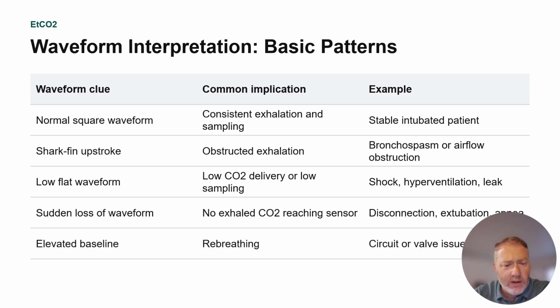And then if there's an elevated baseline, so remember the base of that waveform should be 0, right? If it went from 0 to here, and then your waveform, that indicates that there is CO2 when there shouldn't be. So they're rebreathing CO2.